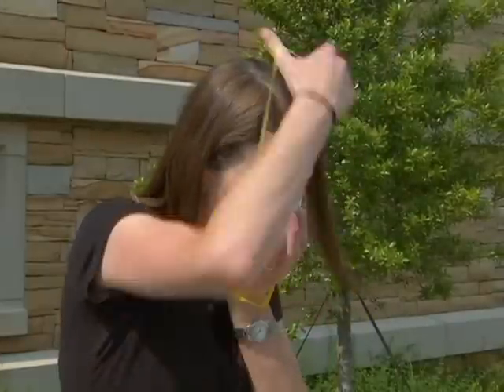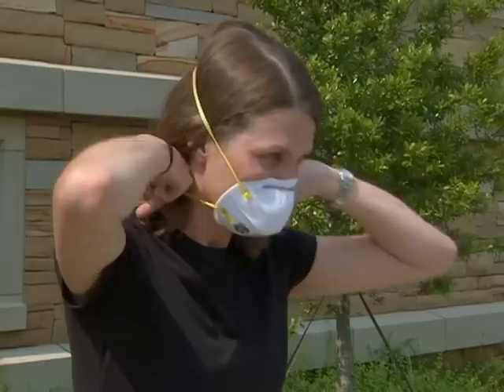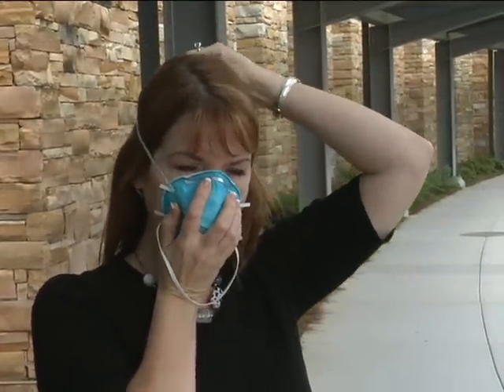Place the respirator on your face with the nosepiece at your fingertips, allowing the headbands to hang freely below your hand. Position the respirator with the nosepiece up. Pull the top strap over your head, resting it high at the back of your head.